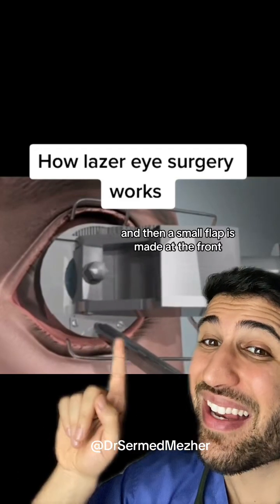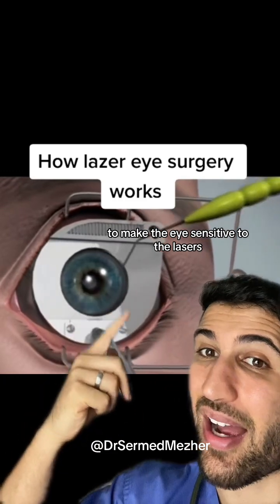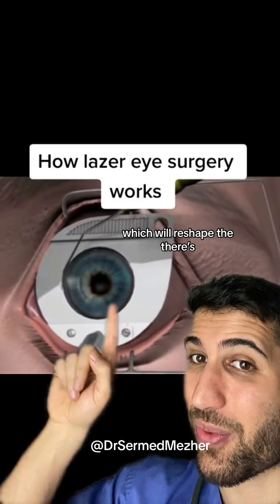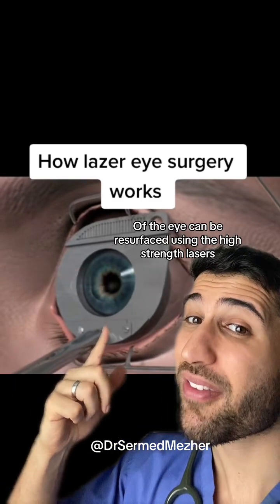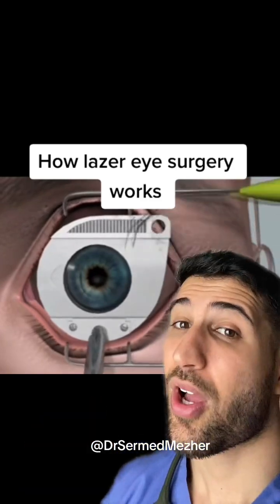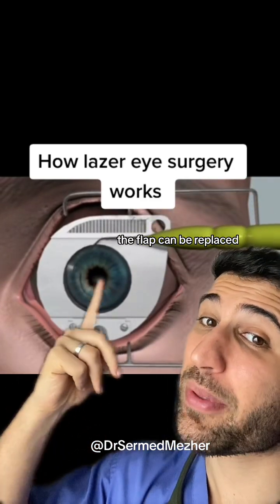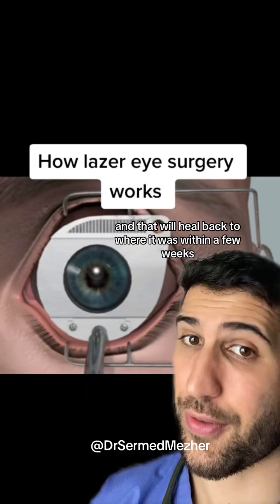To begin with, the eye is numbed and then a small flap is made at the front to make the eye sensitive to the lasers which will reshape it. There's the flap that you can see. The exposed part of the eye can then be resurfaced using the high-strength lasers. Once that's done, the flap can be replaced and that will heal back to where it was within a few weeks.